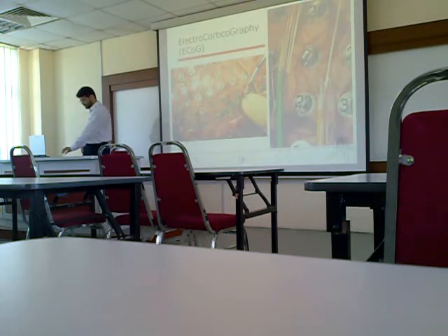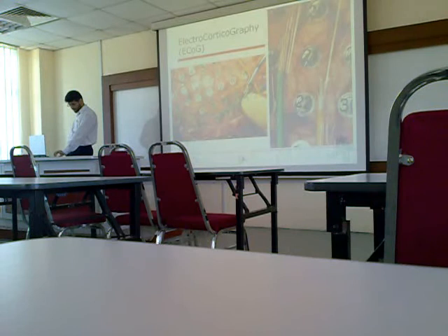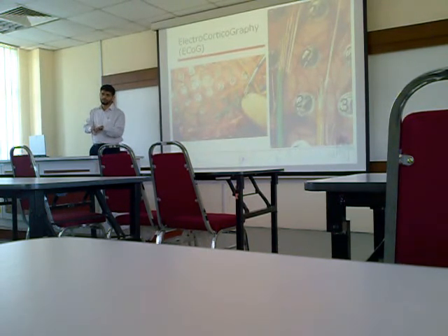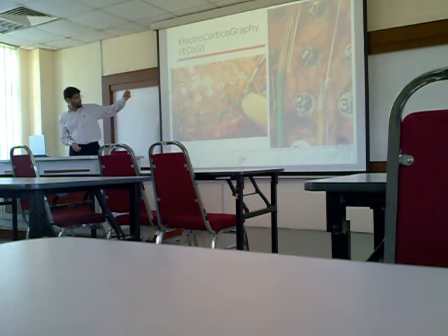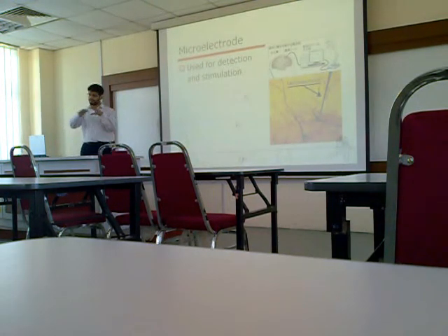The electrodes, you can see, are an array of electrodes, and every electrode is put directly on the brain. Actually, there is some barrier between the electrode and the brain tissue. You can see, maybe, in the picture on that side, the meninges covering the brain.